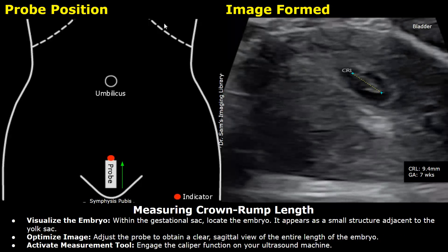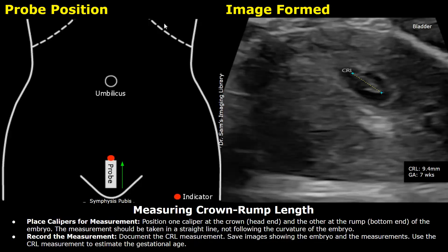Next, we will focus on the embryo to measure the crown-rump length, the CRL, which will give us the estimated gestational age. Adjust the probe to get a clear sagittal view of the entire length of the embryo. Press the caliper function on the ultrasound machine. Place one caliper at the head of the embryo and the other at the bottom end. If it is difficult to differentiate between the head and the rump, just place the calipers at the upper and lower edges. The measurement should be taken in a straight line. In this example, the CRL is 9.4 millimeters, which corresponds to 7 weeks.